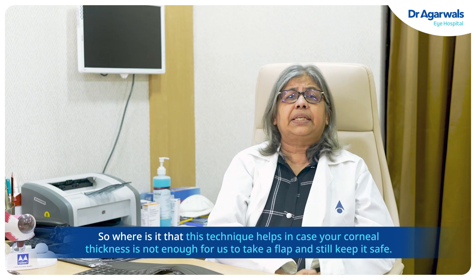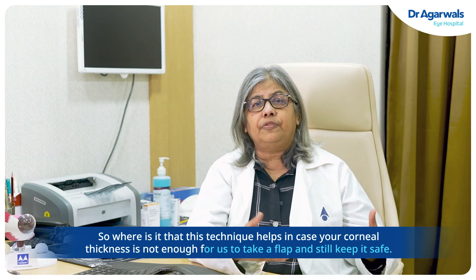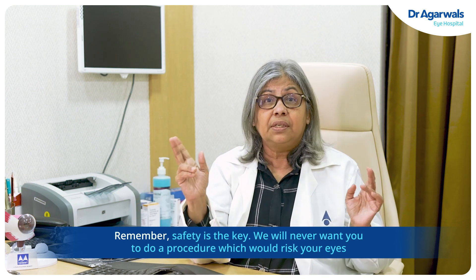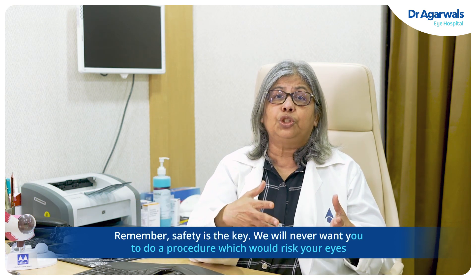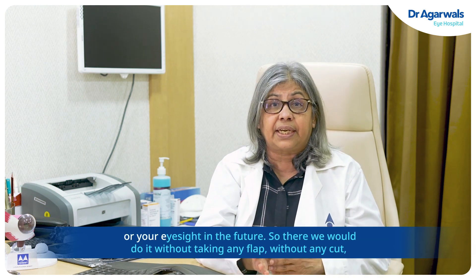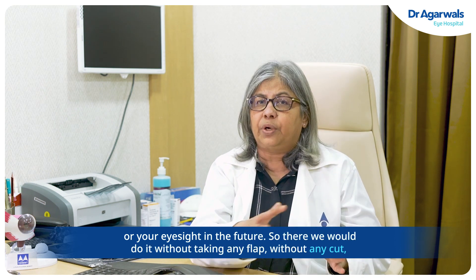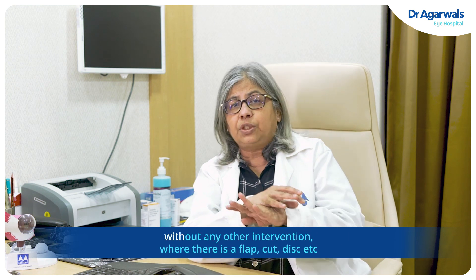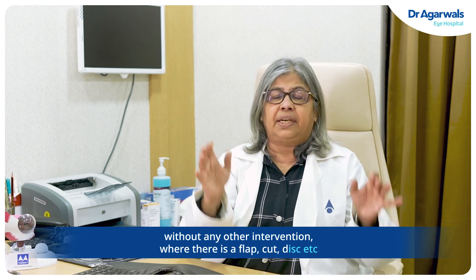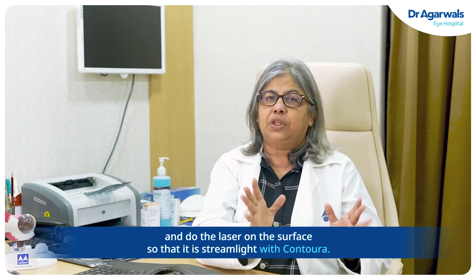So where does this technique help? In cases where your corneal thickness is not enough to take a flap and still keep it safe. Remember, safety is the key. We will never want you to undergo a procedure that would risk your eyes or eyesight in the future. So we would do it without taking any flap, without any cut, without any other intervention involving a flap, cut, or disc — and perform the laser on the surface. That is Streamlight with Contoura.